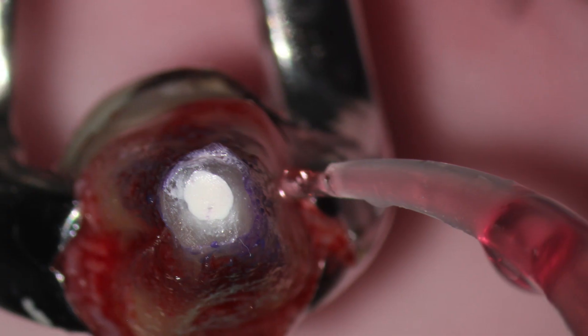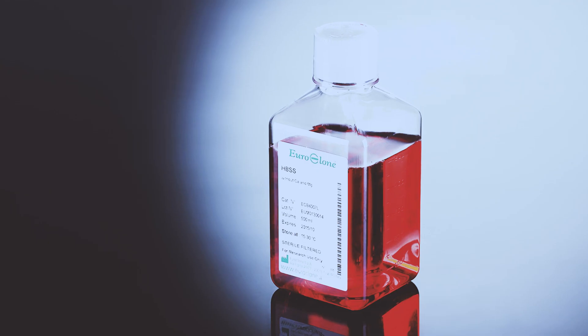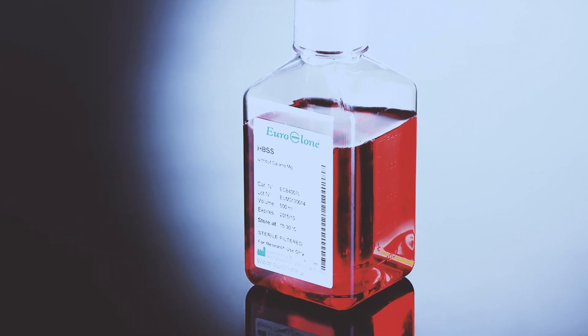I also like to ask my assistant to keep the tooth wet at all times by washing it with an isotonic solution such as Hanks Balanced solution. Let me quickly show you another case I did a while ago.